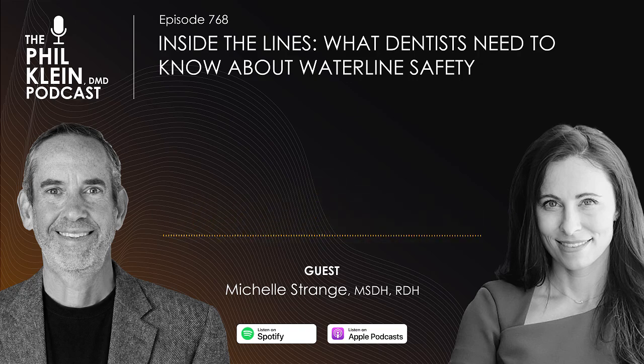Now, let's start with test protocol. The mindset of a lot of these dentists, or whoever's running the infection control team, assistant staff, whatever, is that, like you mentioned earlier, "I'm using the tablets and I use it religiously, or I'm using the cartridge straw system religiously, so I should be good because I keep putting fresh stuff in." But that's not the case.